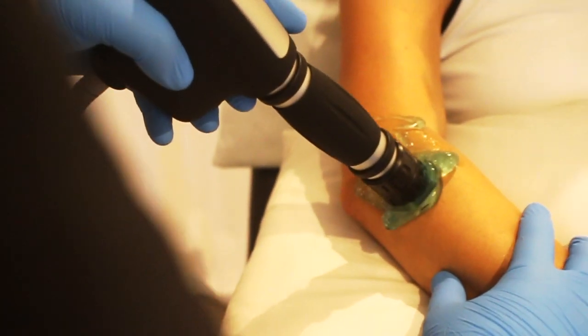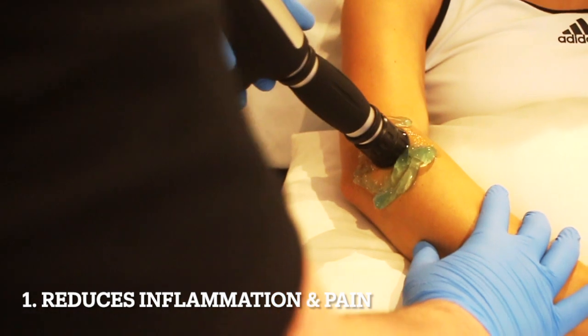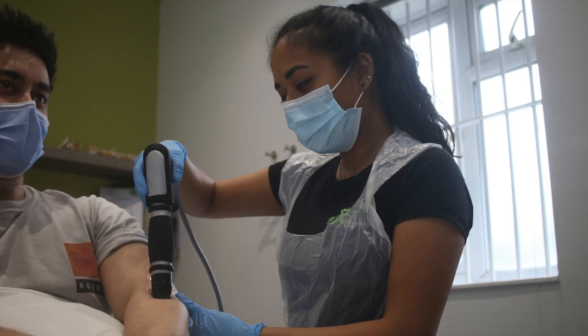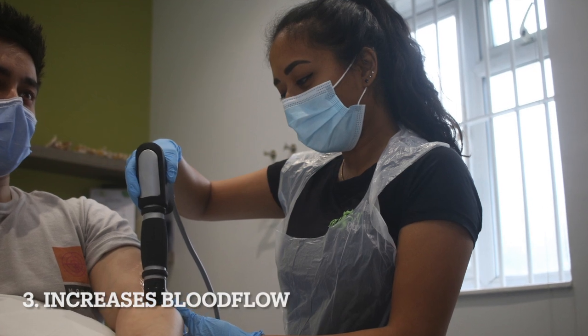And what that does is three main things. One, it reduces inflammation and pain. Two, it stimulates healing. And three, it increases blood flow.